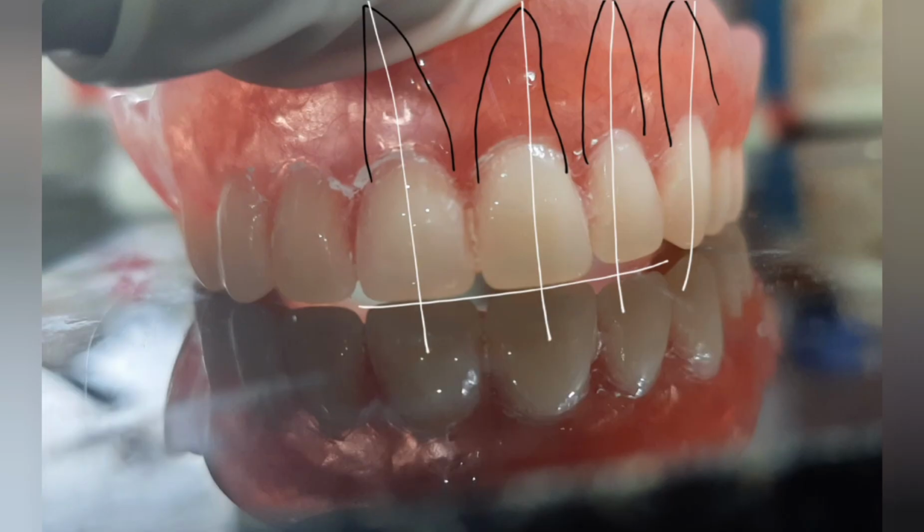After the jaw relation, the size and shape of the teeth is selected according to the high lip line, low lip line, and midline marks. Rule of thumb is always do an ideal setting in all clinical situations. Remove the wax, or in some cases the denture base, to place the central incisors. Once both the central incisors are placed, contacting the straight plane or the glass plate, go for placement of the lateral incisor 1 to 2 millimeters above the occlusal plane. Next, set the canine slightly with a mesial inclination.